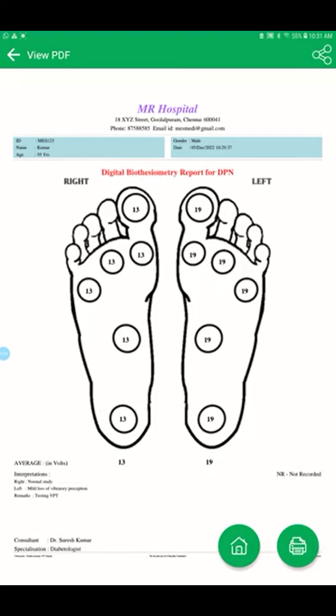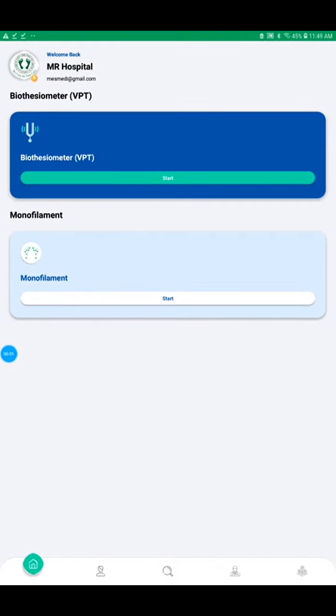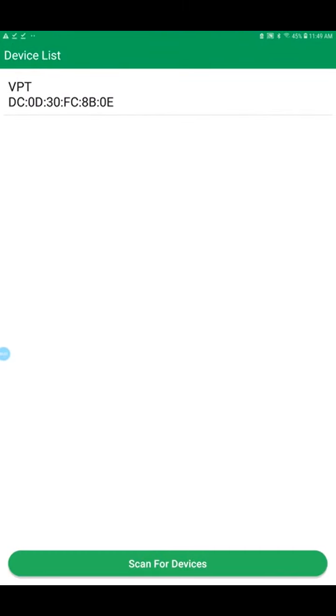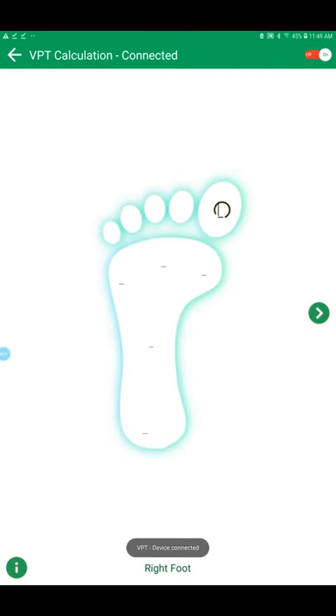On the bottom you can see the home screen button, green color. I just click it and it comes to the main screen. So now we are testing on another patient. I am selecting VPT. Every time I select it, it looks for the device. I have to connect the device, and it will say device is connected.